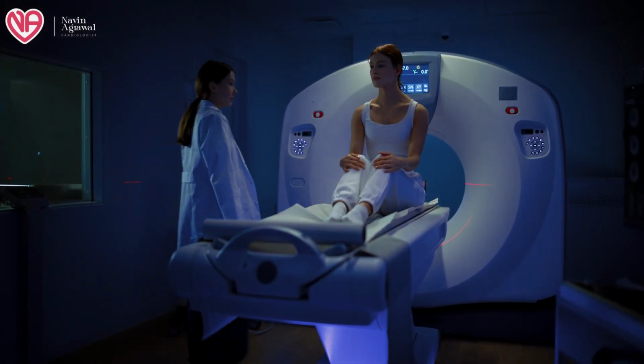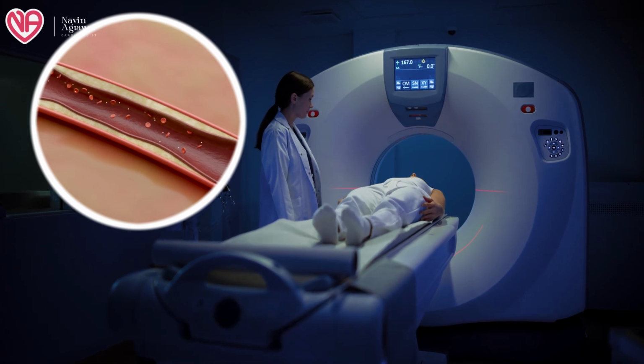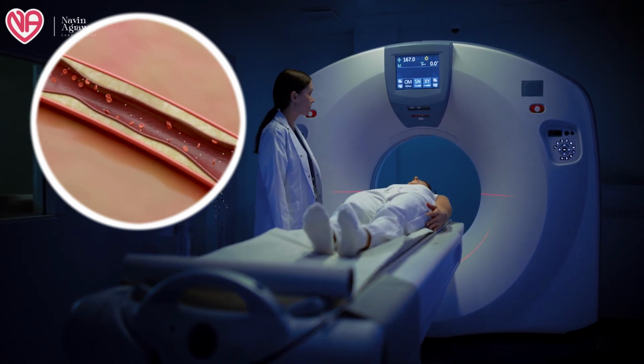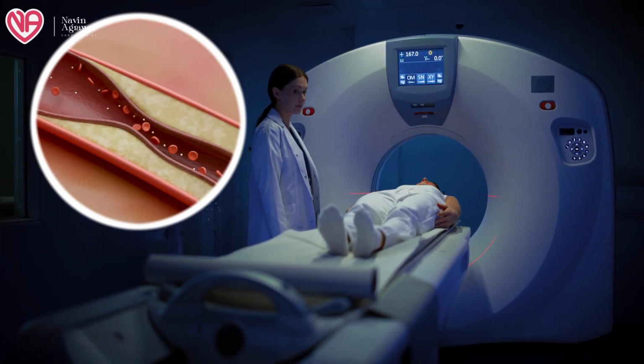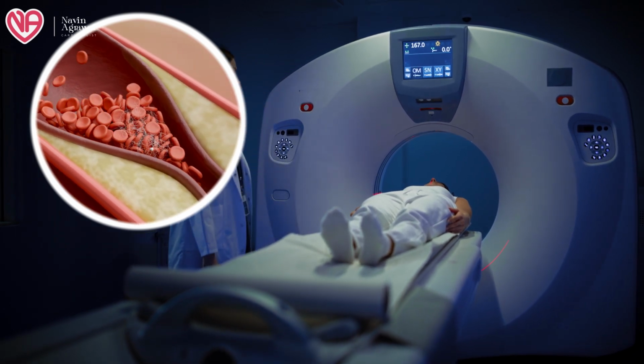Now we come to CT calcium scoring. CT calcium scoring is a much less invasive procedure where we put the patient in a CT scan machine. We do not inject any contrast, and the CT scan machine calculates the amount of calcium which is deposited into the vessel, and by using the intensity of the calcium which is deposited on the vessel, it tells the operator whether the patient is having a significant coronary artery disease or not.